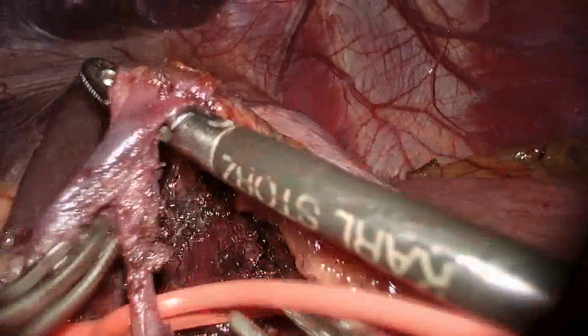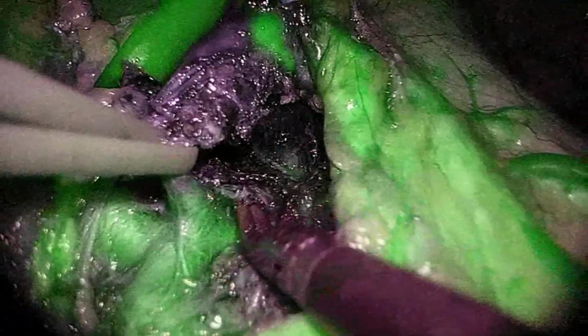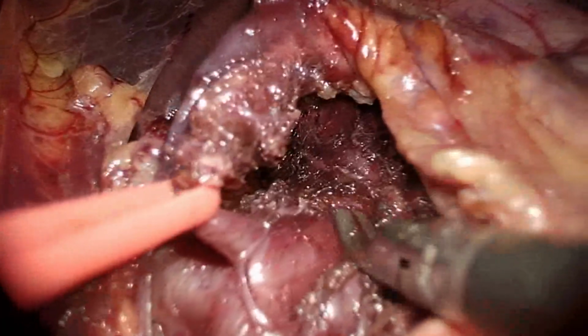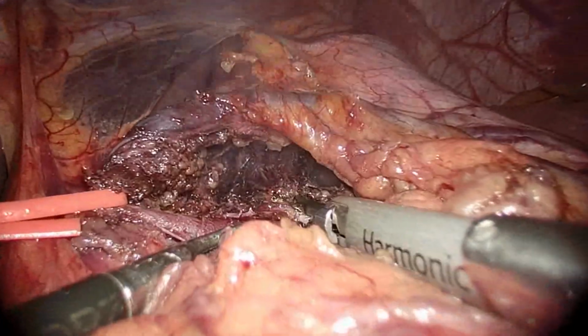For additional traction, we just took a vessel loop and hooked it, and now you can see the ICG image. So that's the tough structure which we had to release properly. Yeah, you can see the give way.